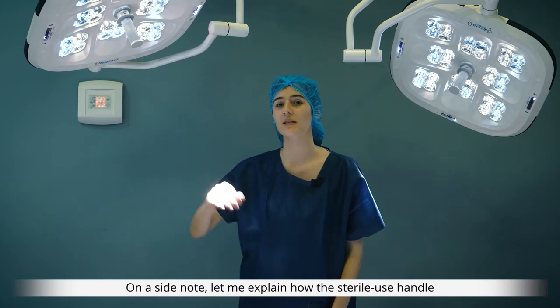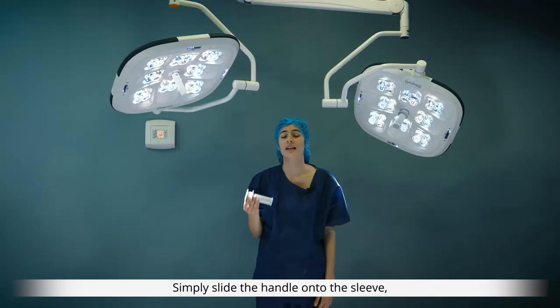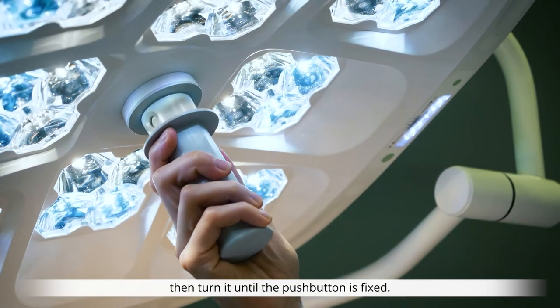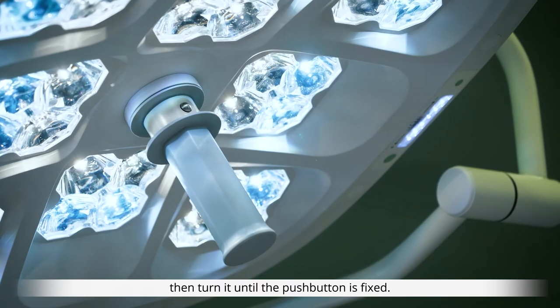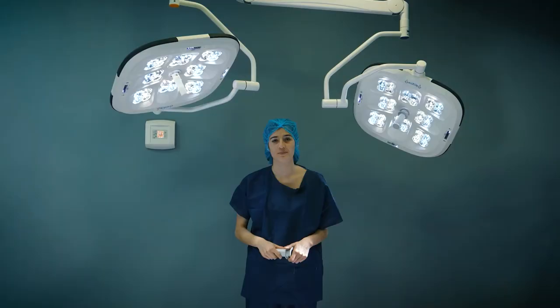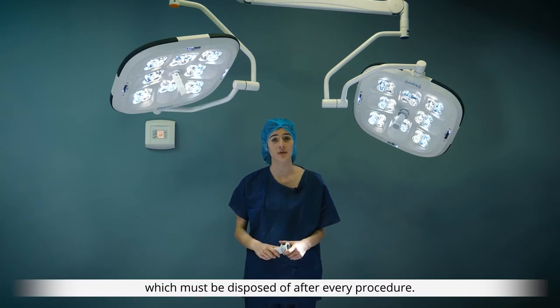Let me explain how the sterile use handle is positioned onto the light. Simply slide the handle onto the sleeve then turn it until the push button is fixed. To remove, simply press the push button and there you go. Our lights may also be equipped with a single use handle support which must be disposed of after every procedure.